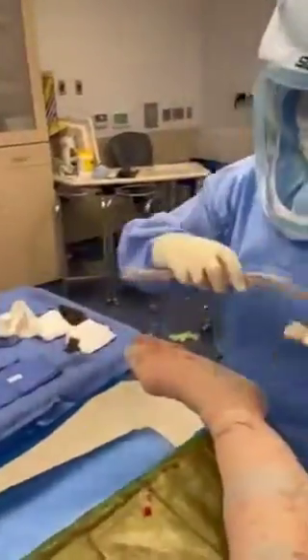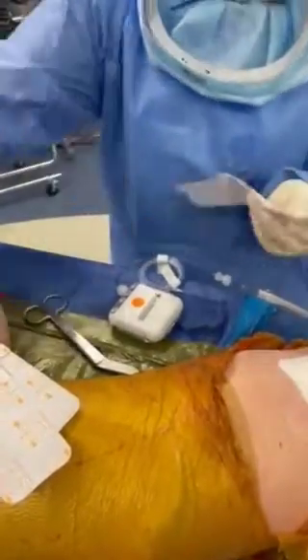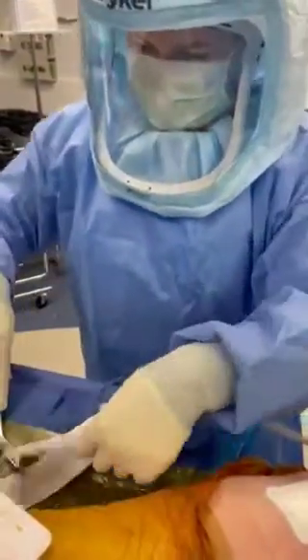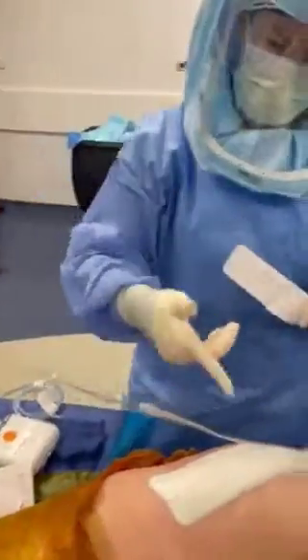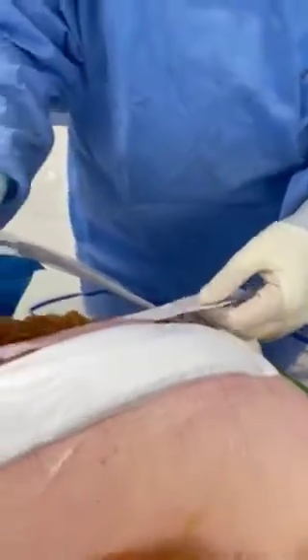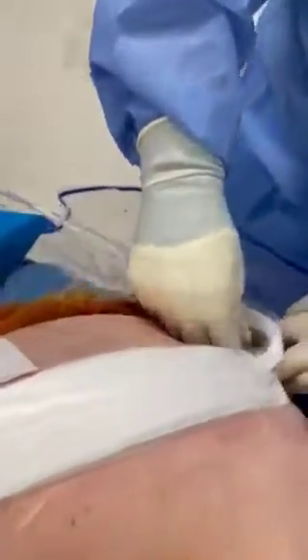We'll get our strips, and what I like to do to make it a little easier for myself for the little end pieces is cut one of these strips right in half. So I'll have those for myself. You can already see without the reinforcements, it's compressing nicely across the wound here. So we'll apply the strips just outside of the white border and smooth those down nicely.